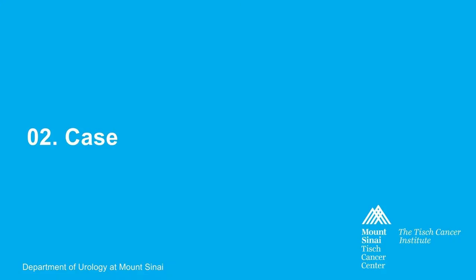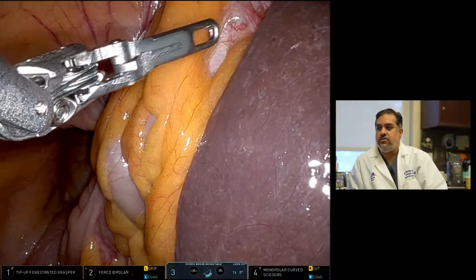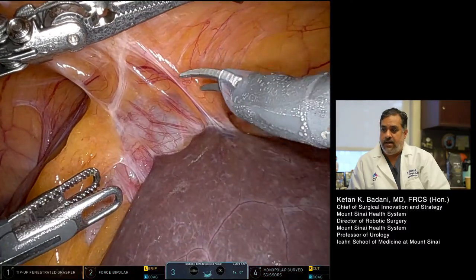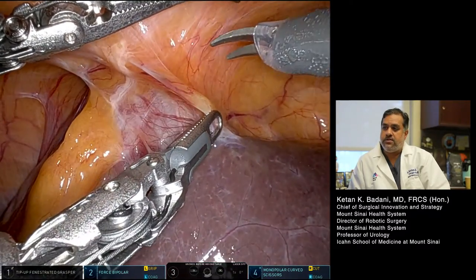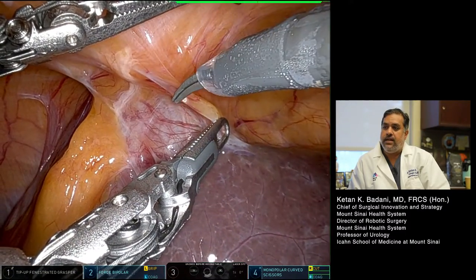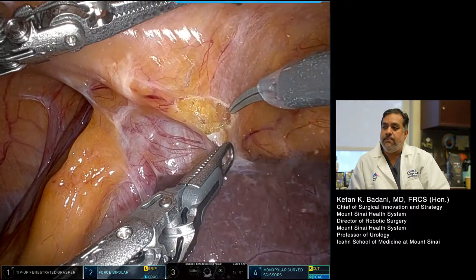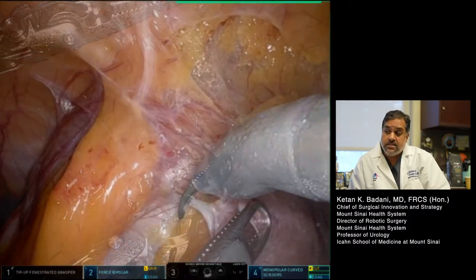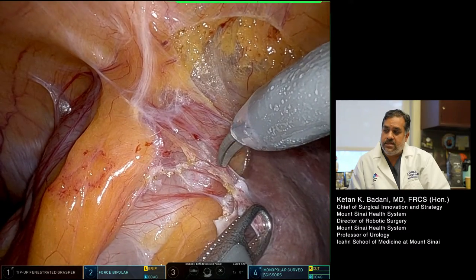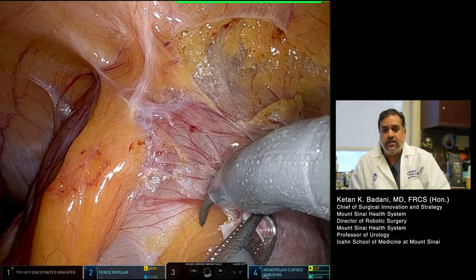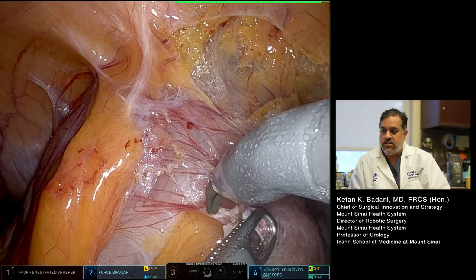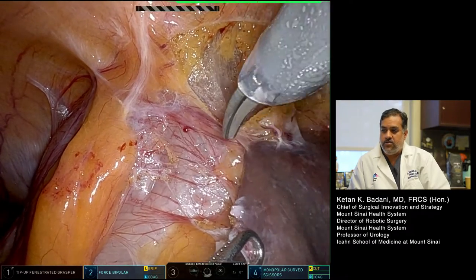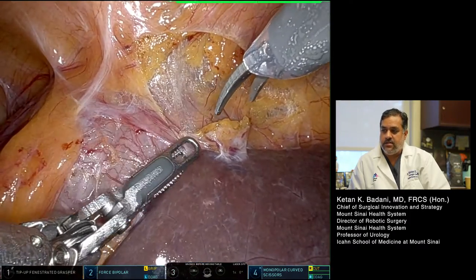I have a very standardized instrumentation and orchestration. I use the force bipolar in my left hand, monopolar scissors in my right hand, and then I'm going to use the tip-up grasper in my fourth arm that's on the top of the screen. Because this is a redo operation, you can see that you have to spend a little bit of time releasing adhesions. Since this was a right-sided tumor, you're seeing the liver adhered to the kidney here.